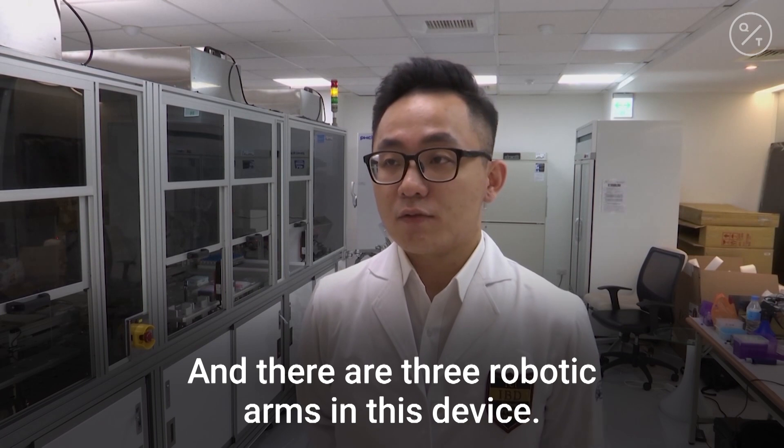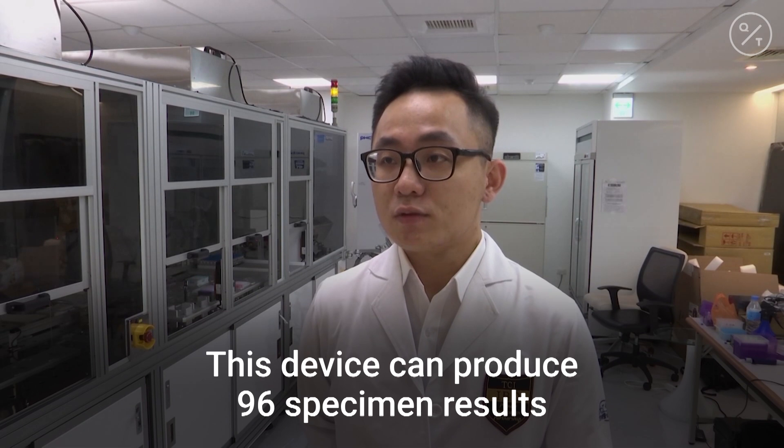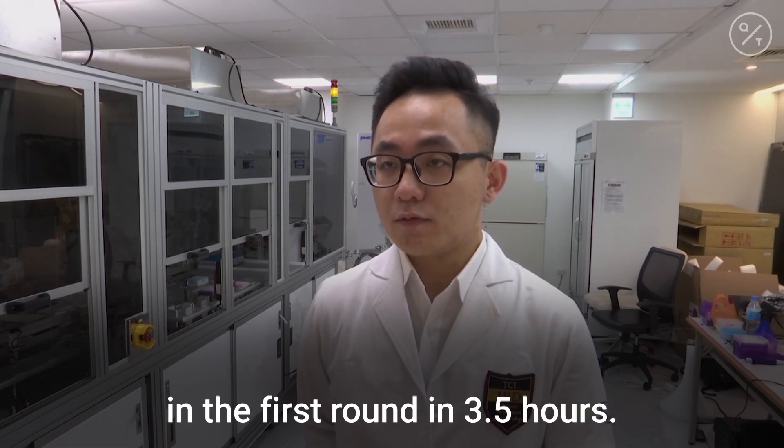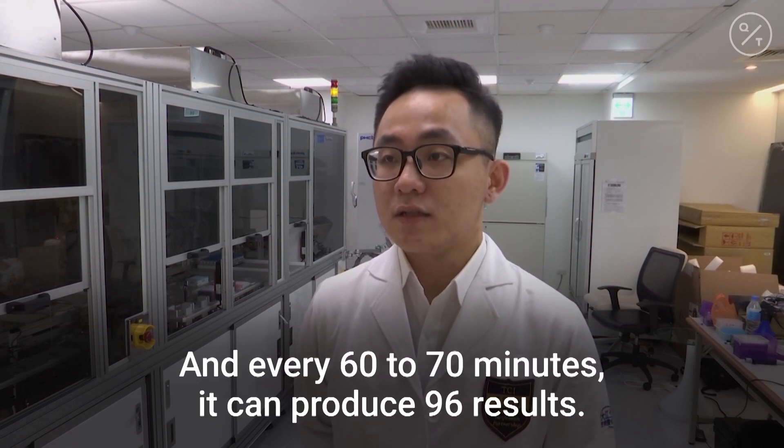There are three robotic arms in this device. It can produce 96 specimen results in the first round in 3.5 hours, and every 60 to 70 minutes it can produce 96 results.